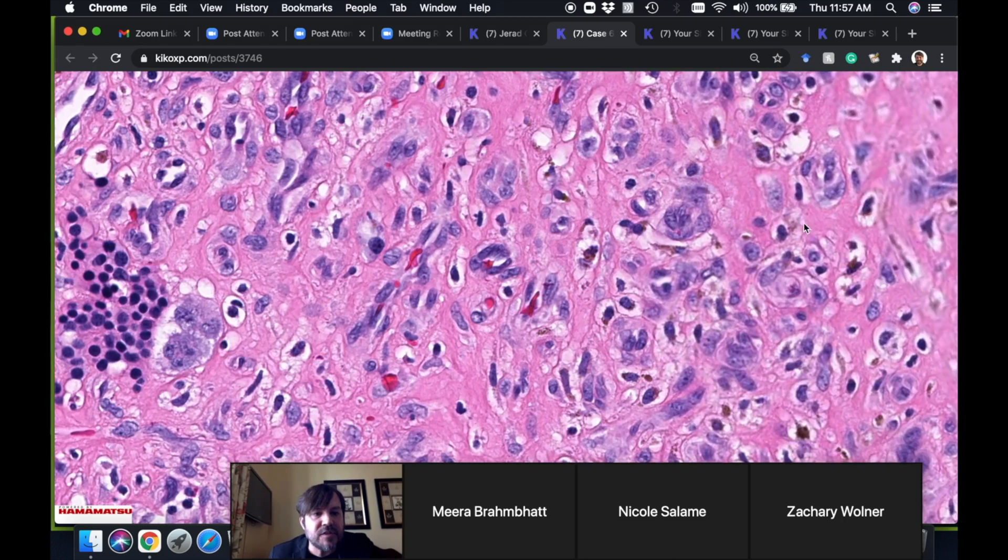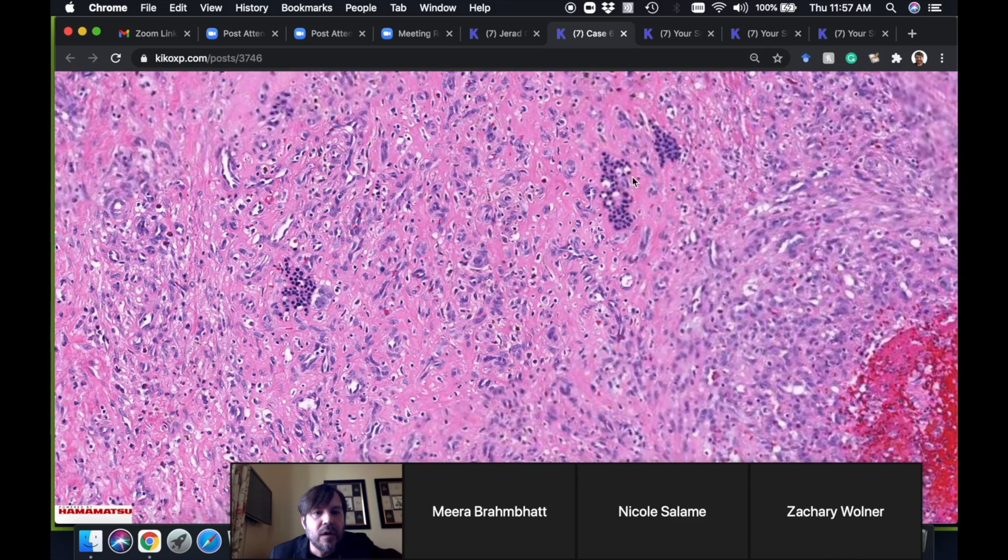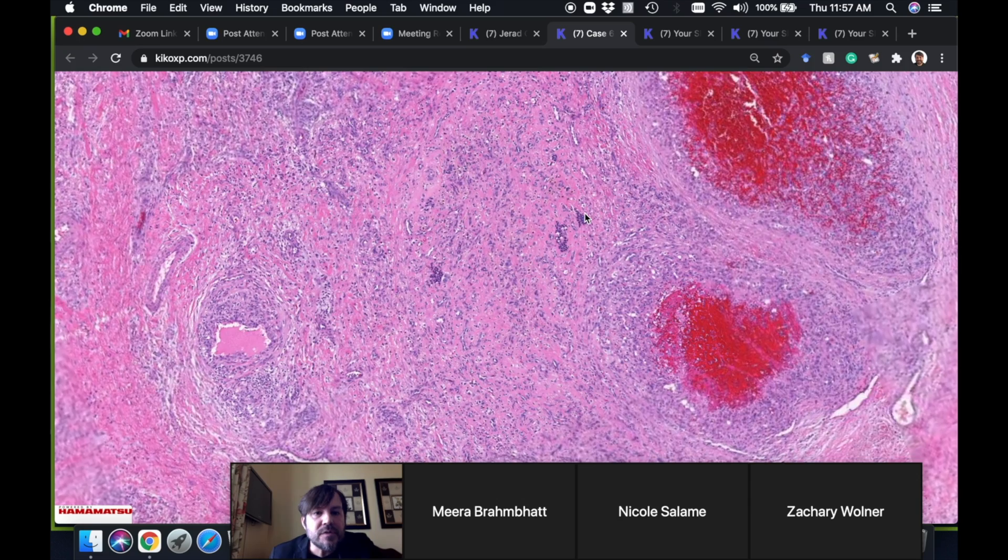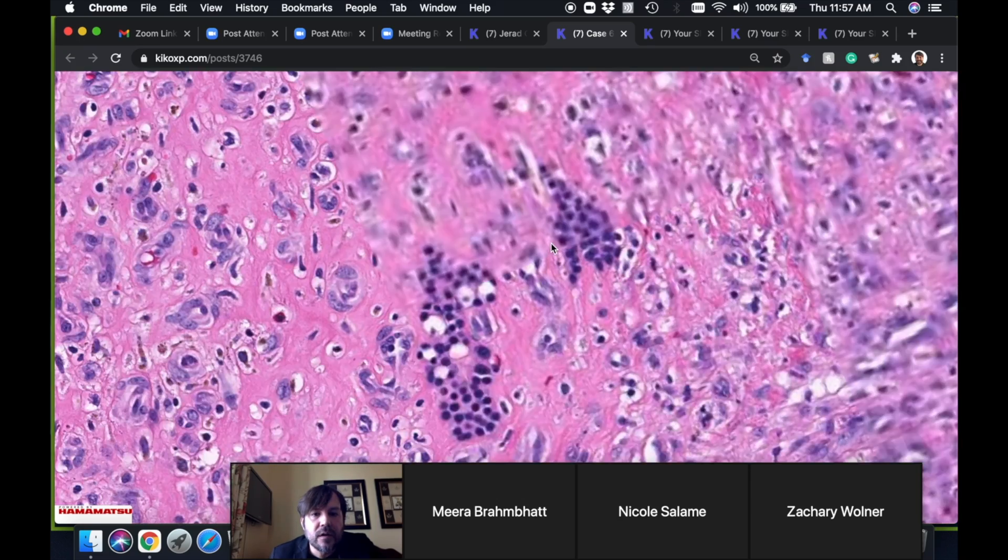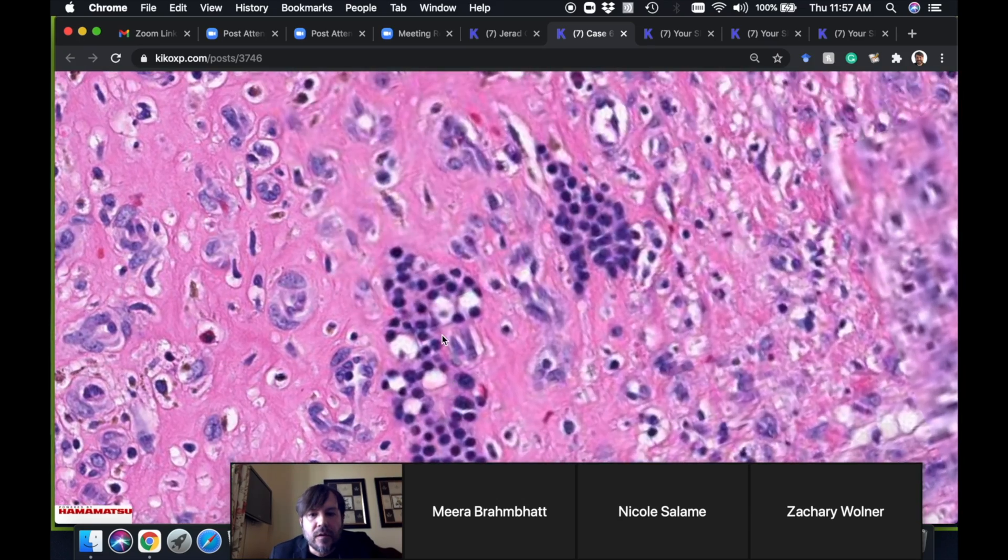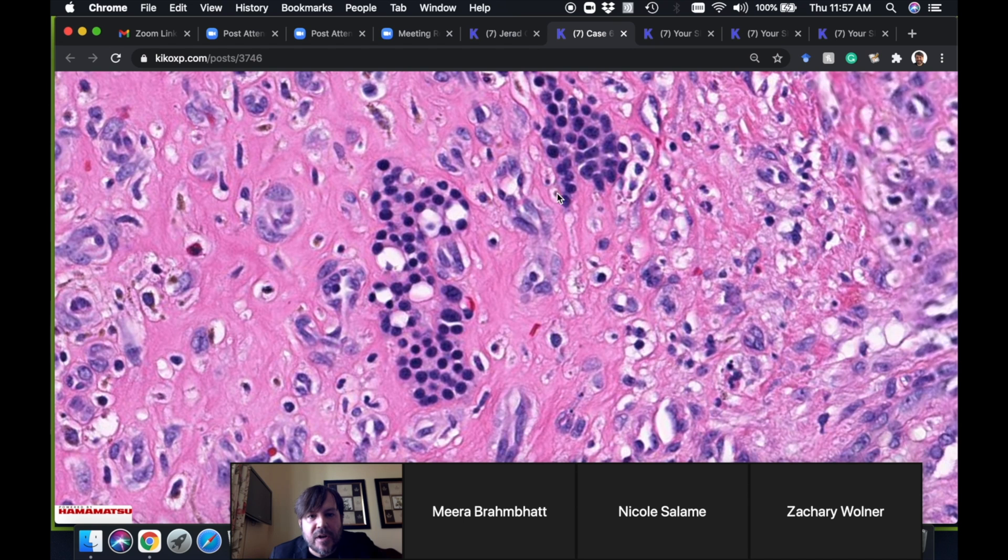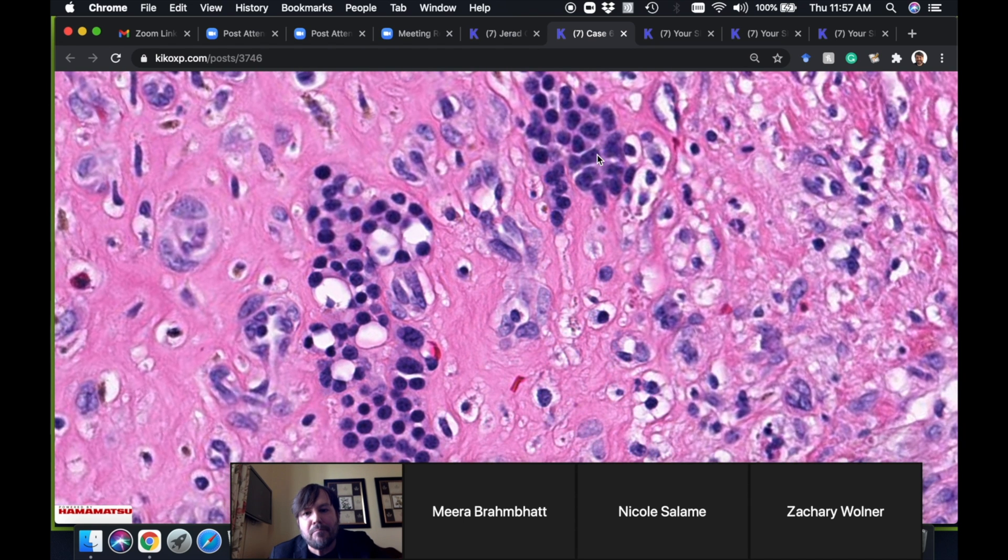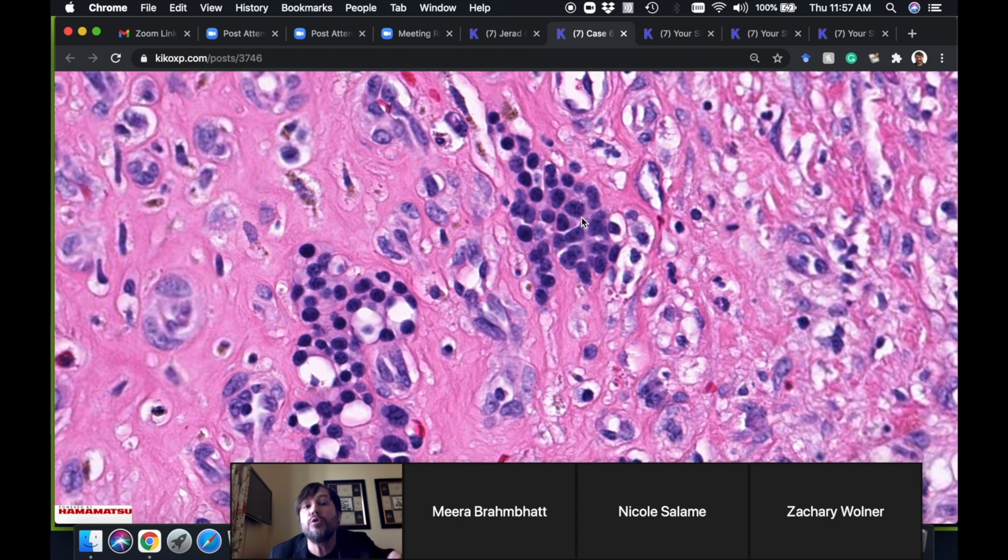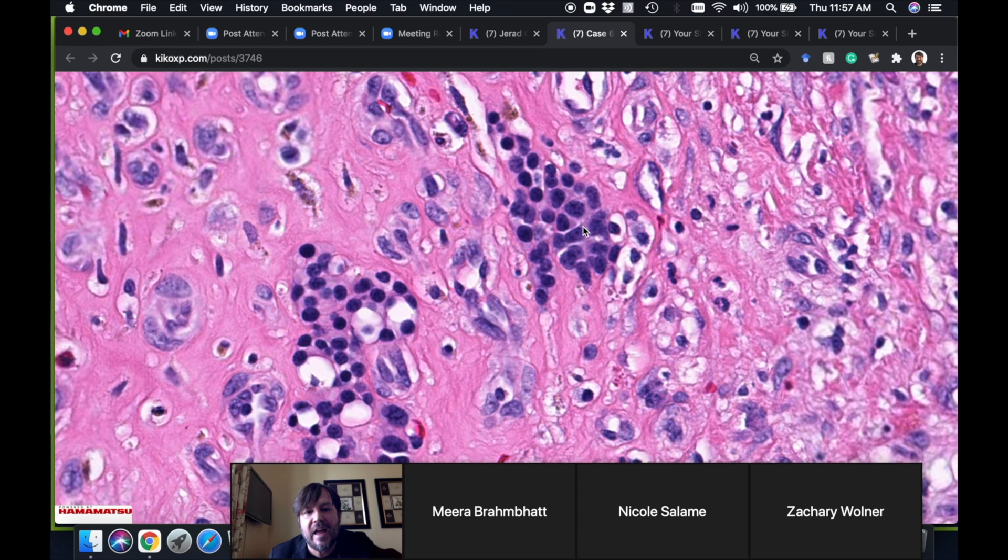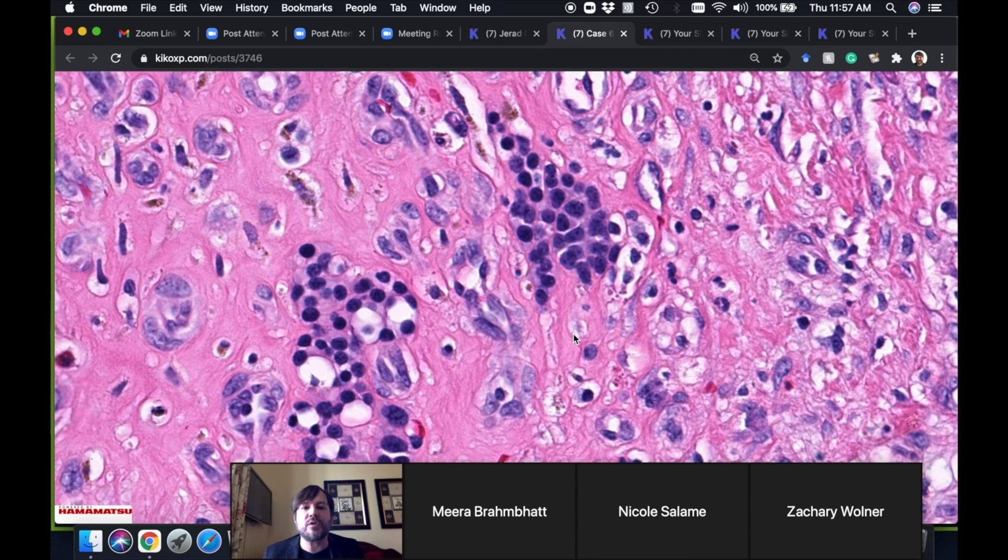These are bone marrow elements basically that are arising here. Over here there's some more of them, and also more of the erythrocyte precursors. These cells right here I think are probably myeloid precursors, so developing neutrophils basically. You can see their chromatin is a little bit different. This is basically what we see in bone marrow, so when it occurs out of the bone marrow we call that extramedullary hematopoiesis.